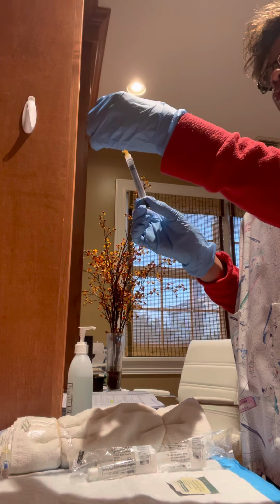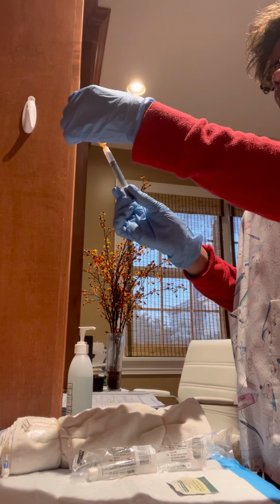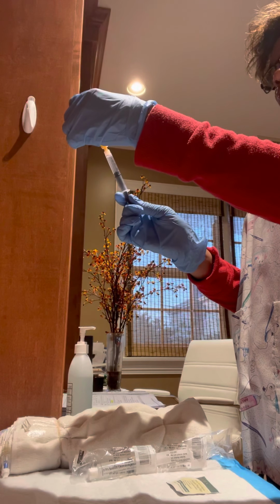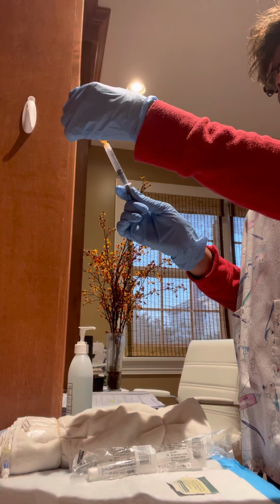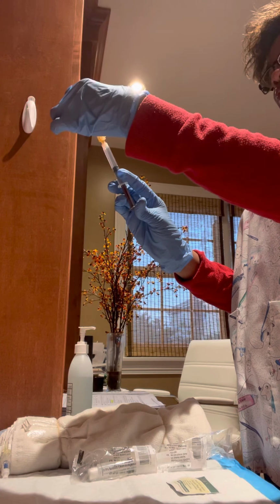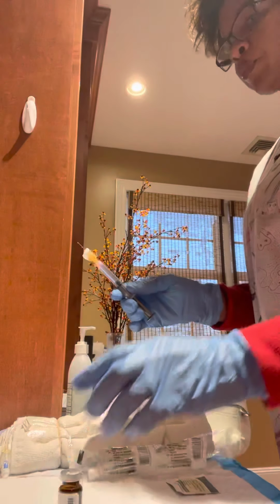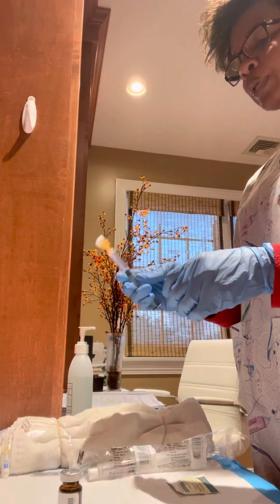Okay, so then I'm going to pull up 2 ml. Okay, so I've pulled up 2 ml, and now I don't need the needle anymore.